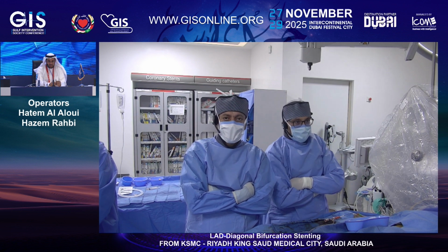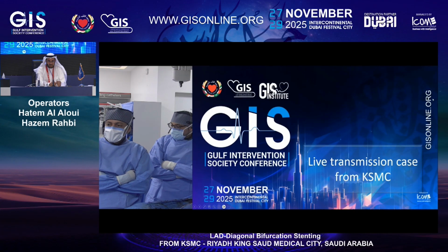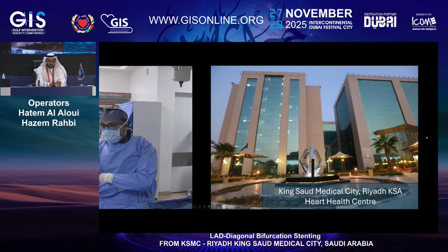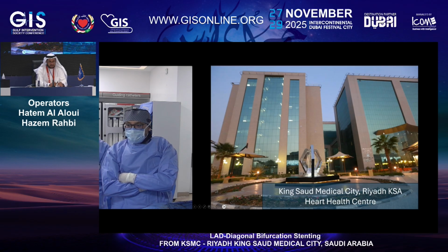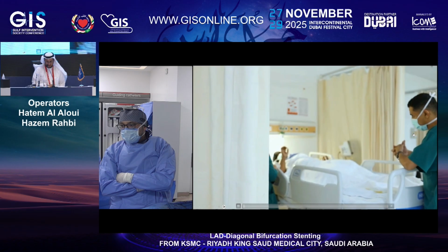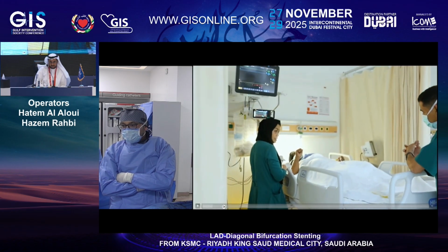I will start with Dr. Hatem to present the case. Thank you so much, Dr. Mubarak, and welcome all the team there in GIS. We will go through the case. We have chosen an interesting PCI, LAD diagonal. Directly the case, please. Next slide.